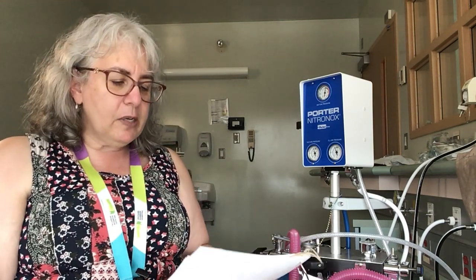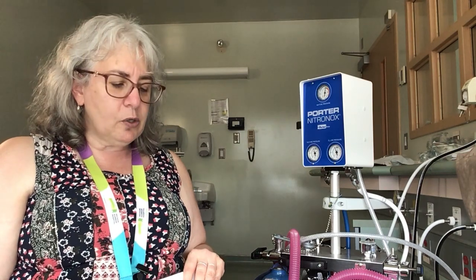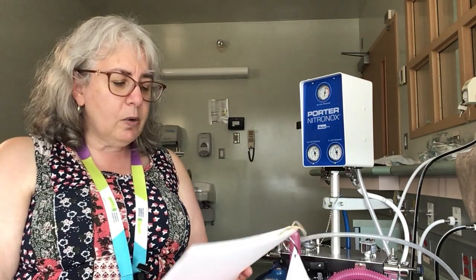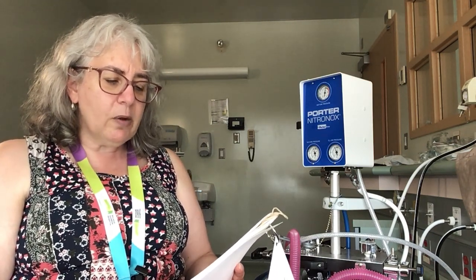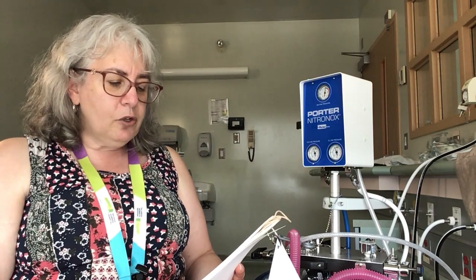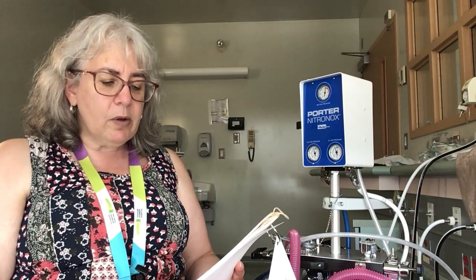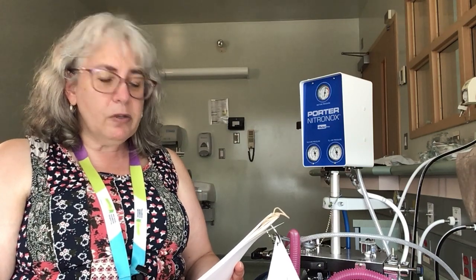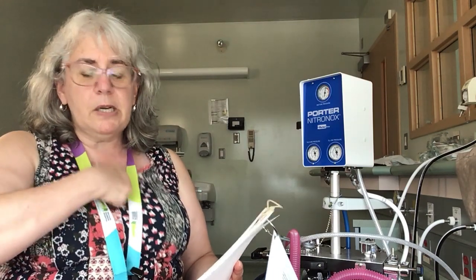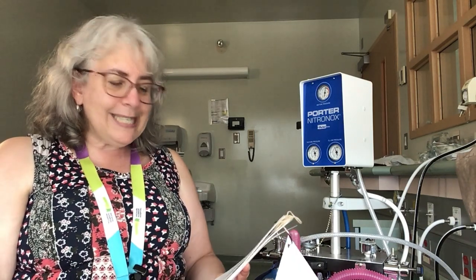Falls risk assessment, and the other piece that's a bit different is a sedation score and a pain score. That's every 15 minutes. And sedation score is the normal sedation score that we use when patients are on PCA narcotics. So 0 is none, 1 is mild, which is occasionally drowsy or easily aroused. 2 is moderate, which is frequently drowsy, easily aroused. 3 is severe, which is a somnolent patient or very difficult to arouse, where you maybe need to give a little sternal rub. And S is sleeping.